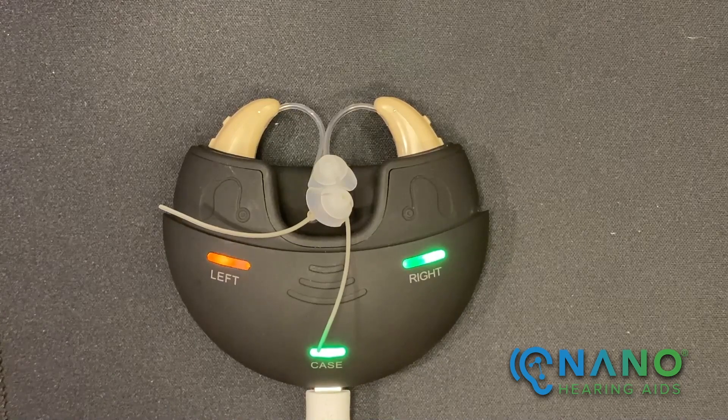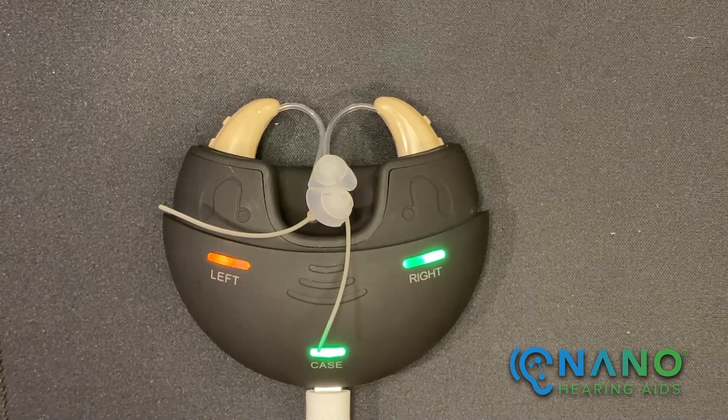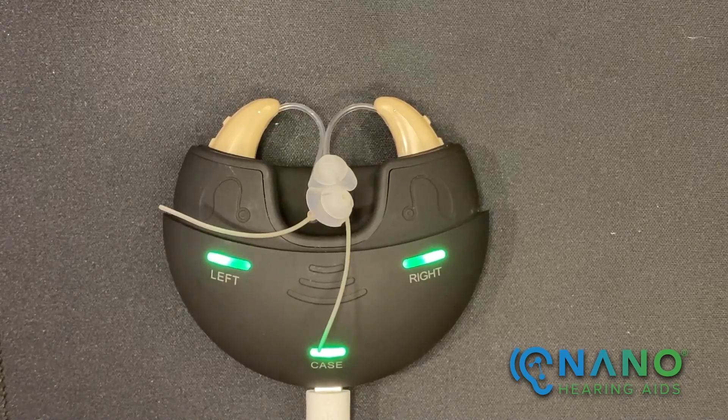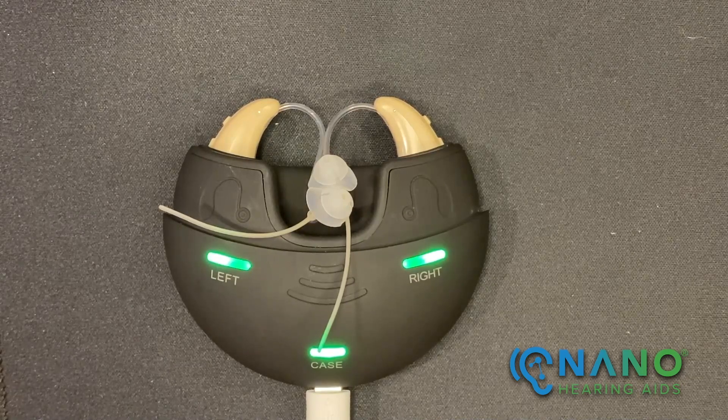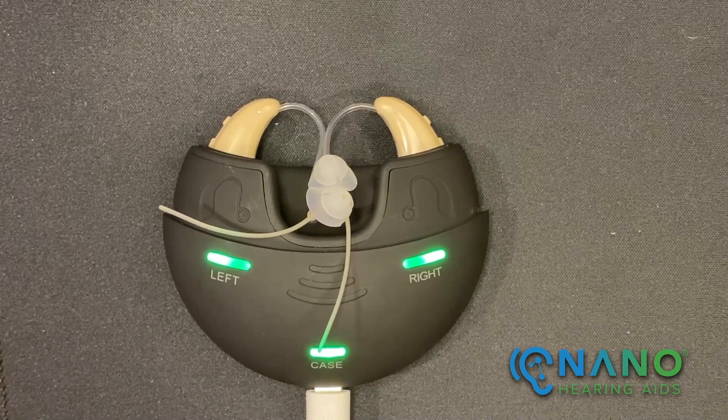Hearing aids powered off prior to charging will remain off when removed from the charging case — you simply have to turn them on before using. Hearing aids may also be left in the charging case overnight or for an extended period of time.